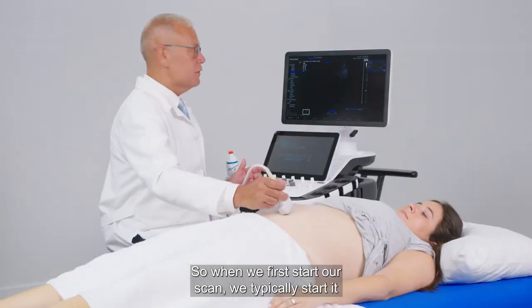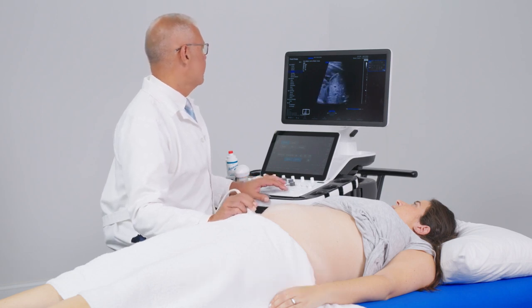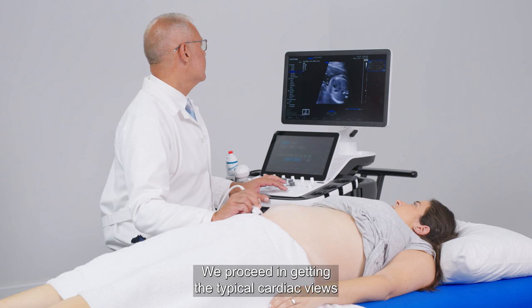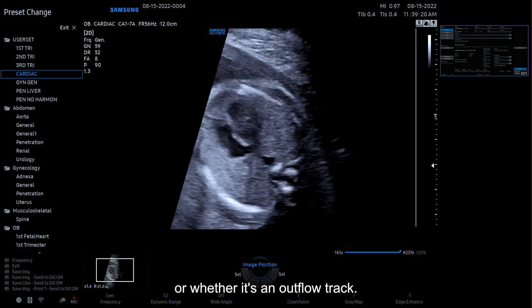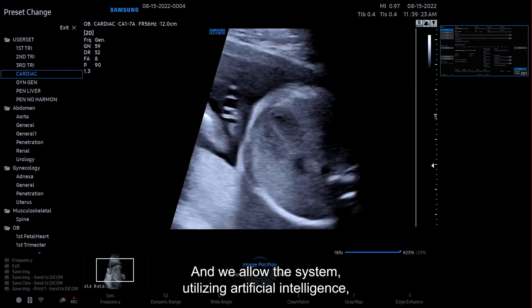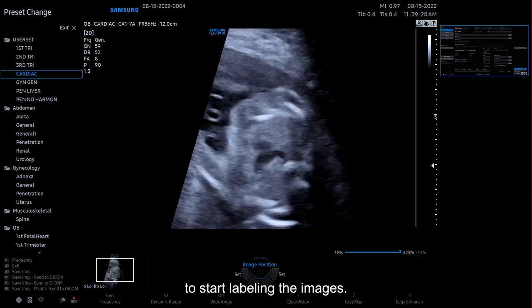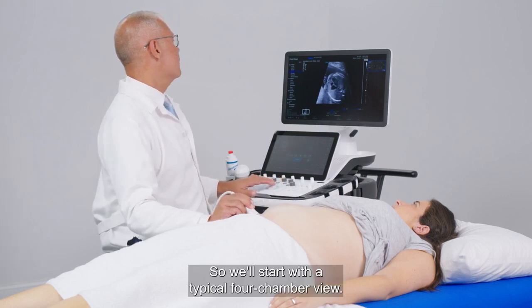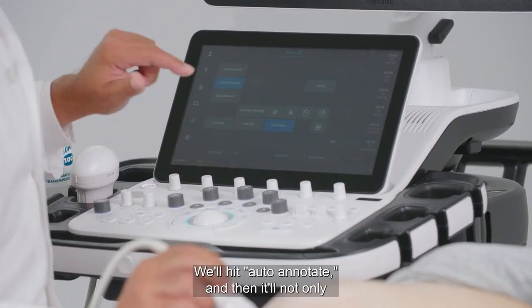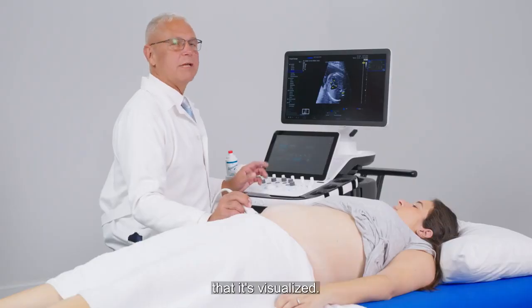So when we first start our scan, we typically start just like we normally would any other cardiac scan. We proceed in getting the typical cardiac views, whether it's a 4-chamber or an outflow tract, and we allow the system, utilizing artificial intelligence, to start labeling the images. So we'll start with a typical 4-chamber view. We'll hit auto annotate, and it'll not only give us the reference that it has located, which is the spine, but also the chambers that it's visualized.